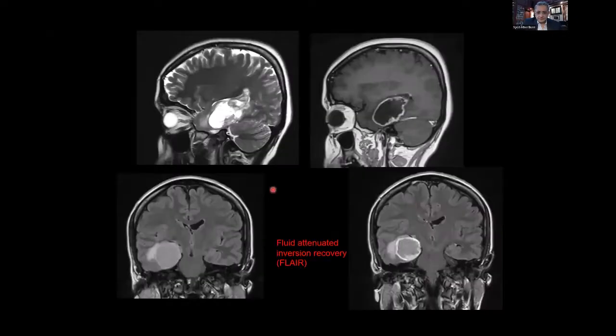And so this is another picture, same patient, it was a GBM. You see this material over here. This is T2 because CSF is white. You can see in the globe also it's hyperintense, and here it's with contrast.